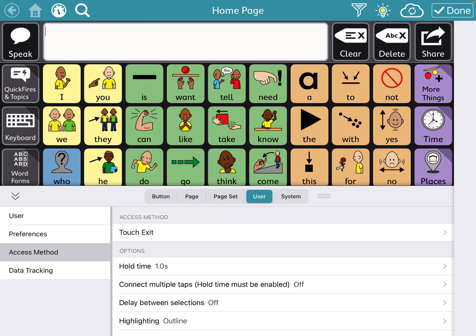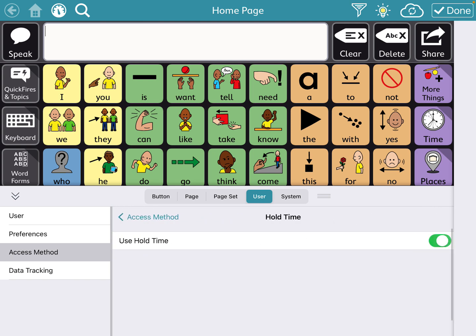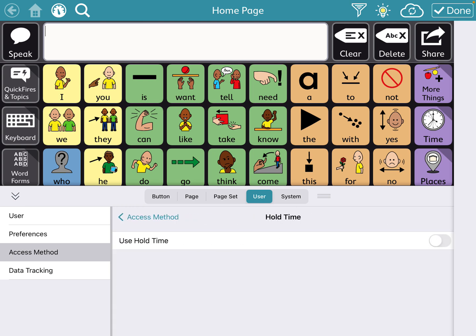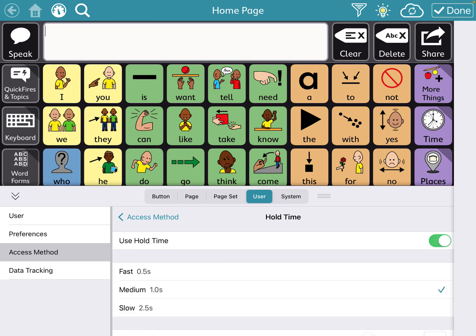And so you'll see that hold time is the first option down. So this will mean that they have to have a hold time on the button. When you turn it on, there's slow, medium, fast. So this really depends on the child's motor skills.